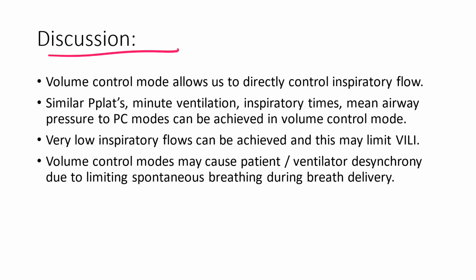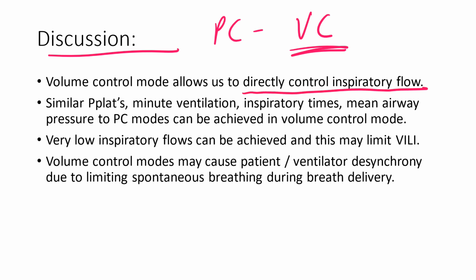So when we compared pressure control to volume control, we can see quite a few differences. Volume control mode allows us to directly control that inspiratory flow. All right, we can achieve the same P plats, the same minute ventilation, the same inspiratory time, the same mean airway pressures, all those critical factors to control the P plats of the patient and minute ventilation and control pH of our patient are being achieved the same as they would be in pressure control. All right, the difference is that we can have very low inspiratory flows, and this may be important to limit ventilator-induced lung injury, and that's what I'm suggesting today.